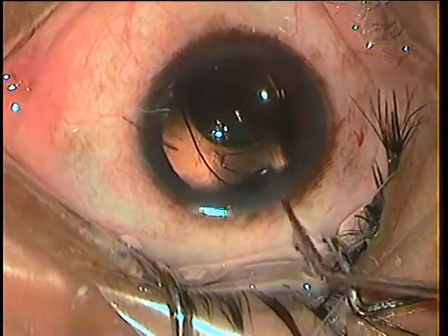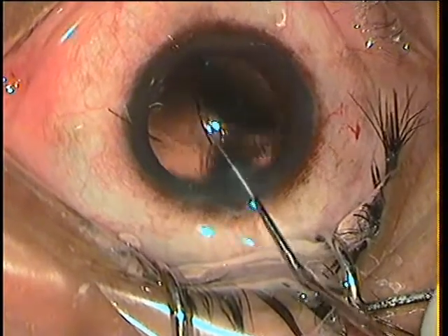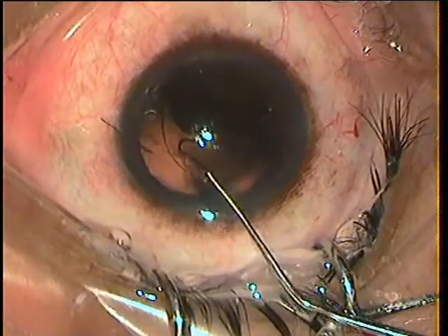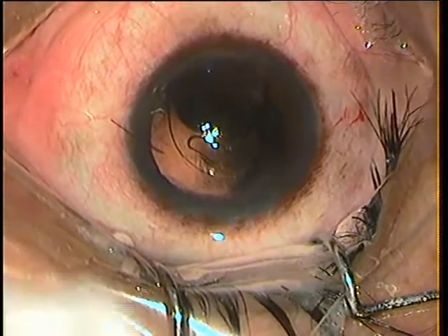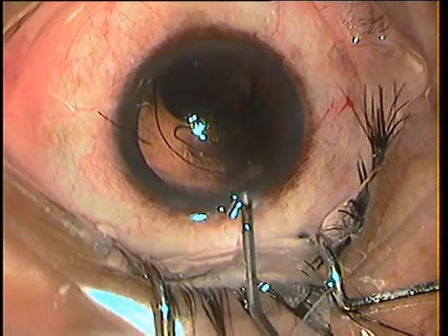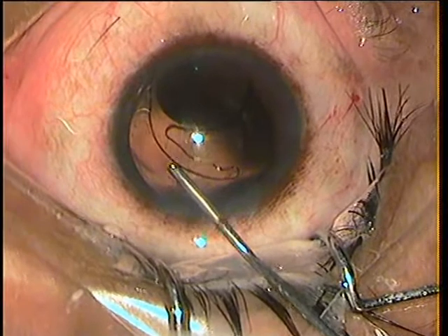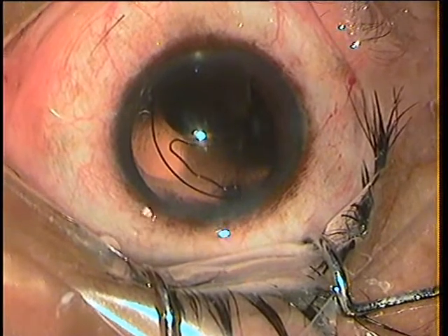Now I shall bring the intact haptic near the wound so that I can grasp it and pull out the legs. Having a vent in the posterior capsule at this stage would be very tragic. So time and again, I pull the posterior capsule away from my instrumentation.